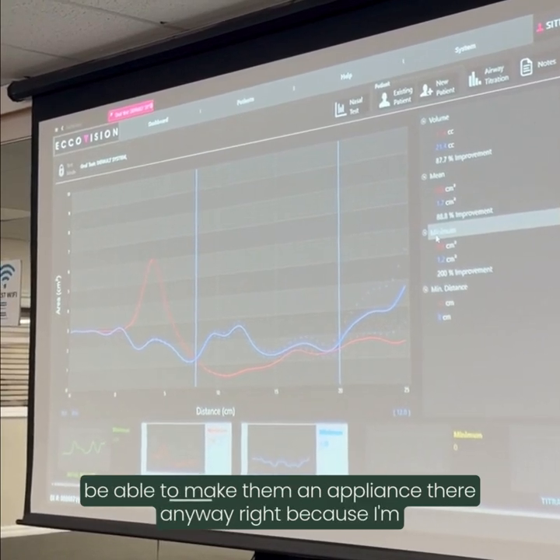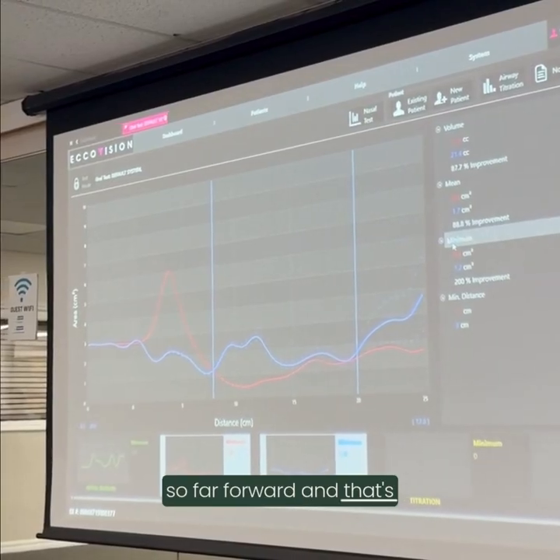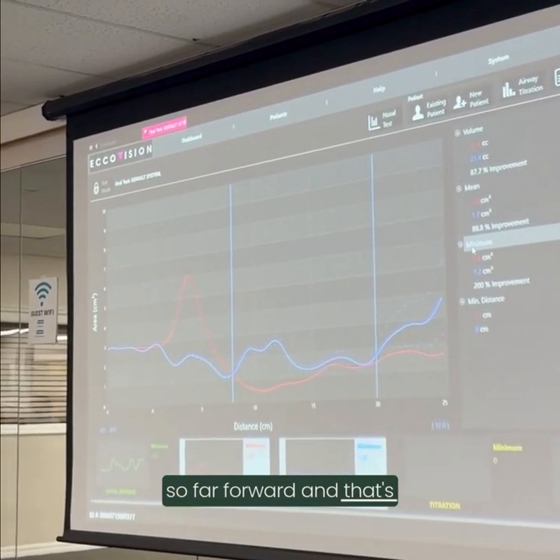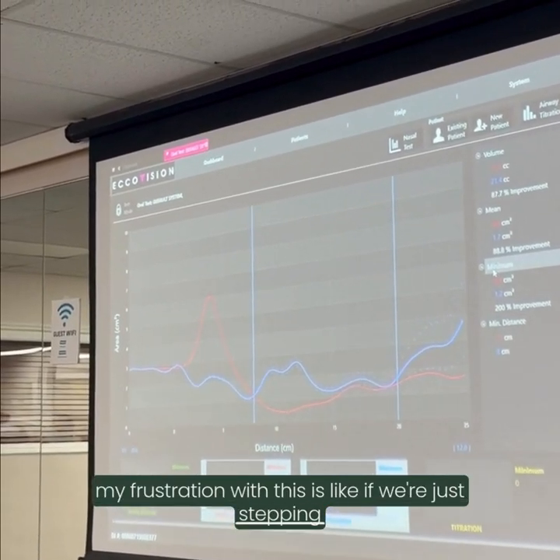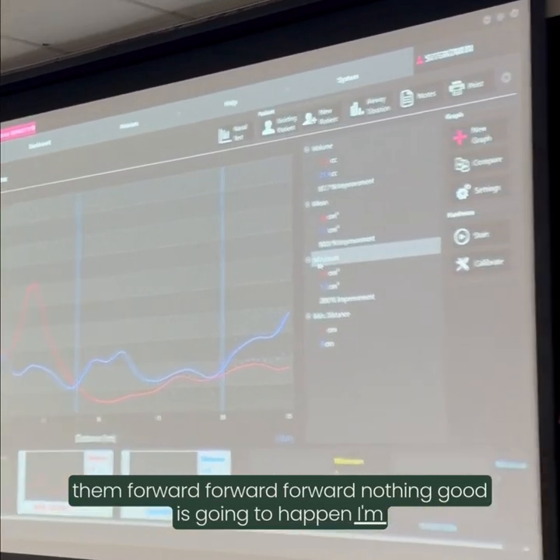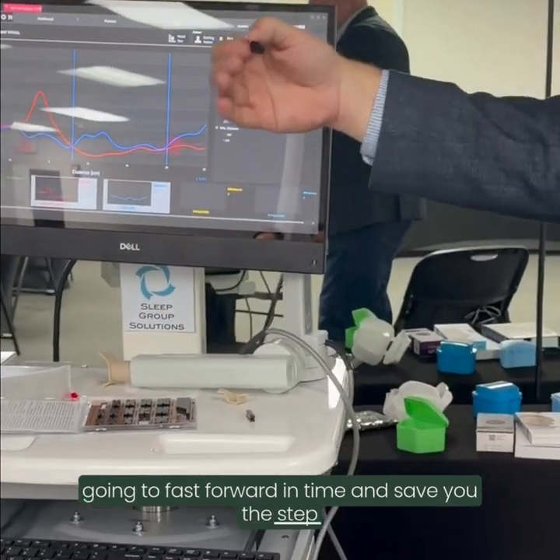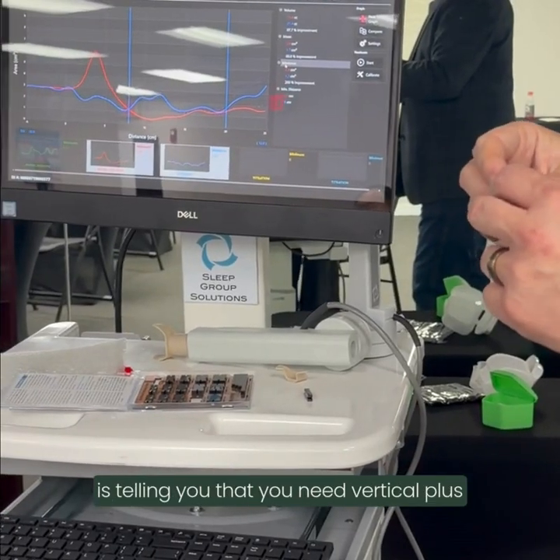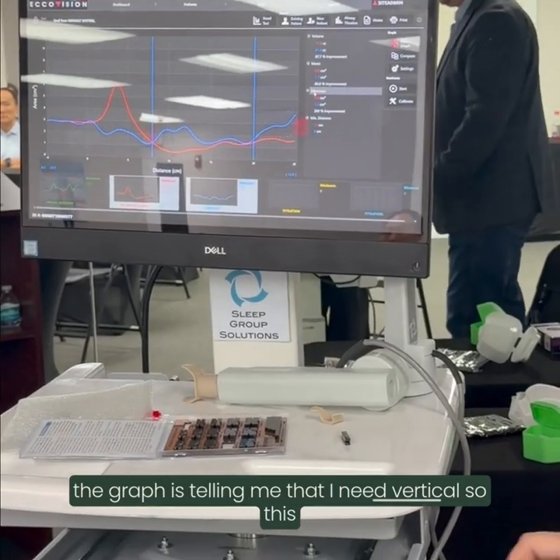Now, I wouldn't be able to make them an appliance there anyway, because I'm so far forward, that would be painful. And that's my frustration with this: if we're just stepping them forward, nothing good's going to happen. I'm going to fast forward in time and save you the step-by-steps of all of these. Plus the graph is telling me that I need vertical.